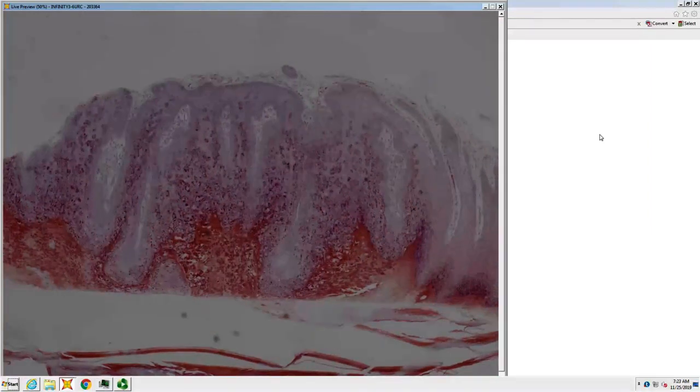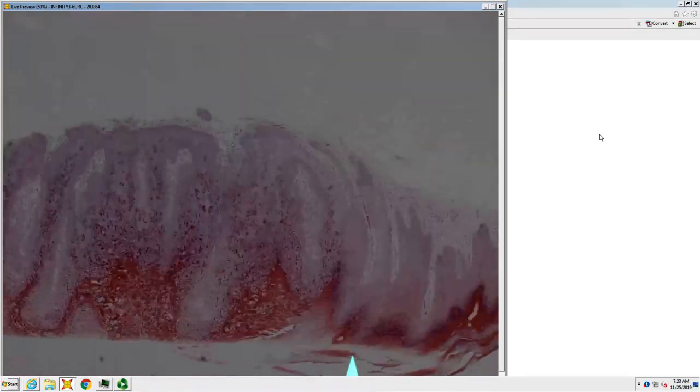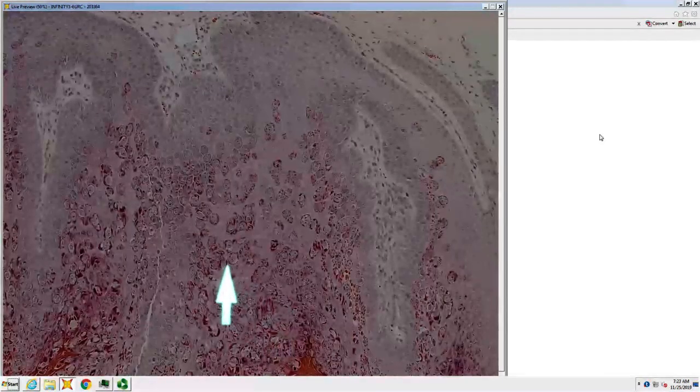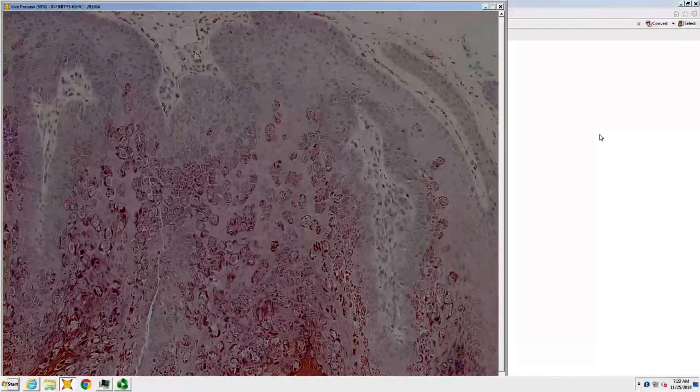Blister. Probably artifactual. So it's myrmecia. So first off, you're on palmoplantar skin. Myrmecia means anthill because clinically it resembles a deep burrowing lesion. And then you see the red, coarse red chunks which characterize HPV type 1, which when it is a deep palmoplantar wart is myrmecia.